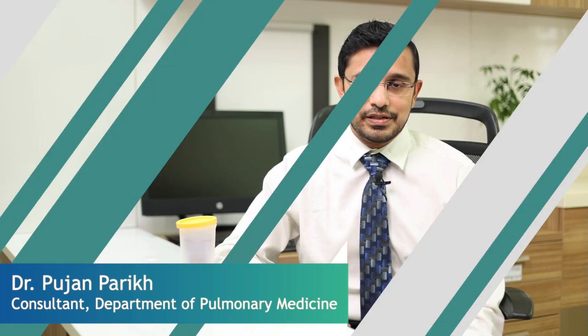Inhaler therapy is an important mode of drug delivery for asthma. Basically, it is the first line of management as per the GINA as well as GOLD guidelines for the asthmatic and the COPD patients. The advantage of this inhaler therapy is that you need a lesser dose and you get a better efficacy. The drug is directly delivered into the airways and has fewer systemic side effects. This is the main advantage of inhaler therapy.